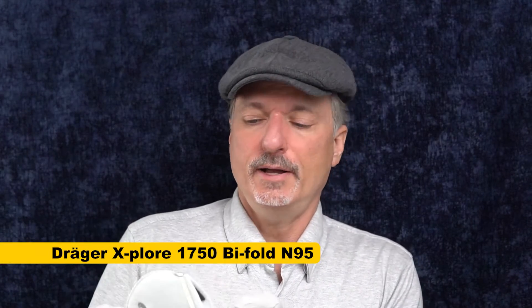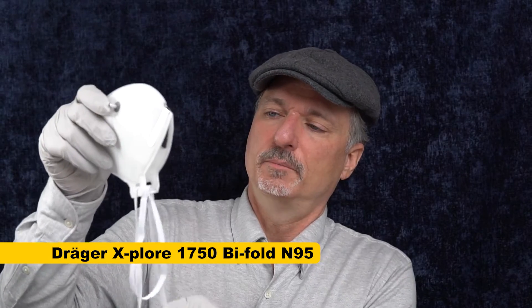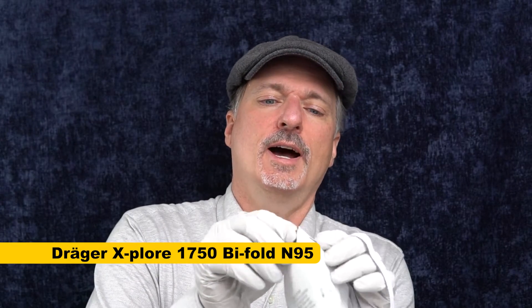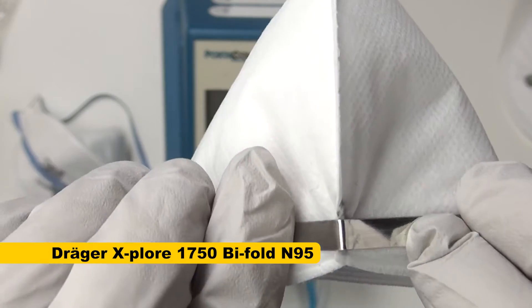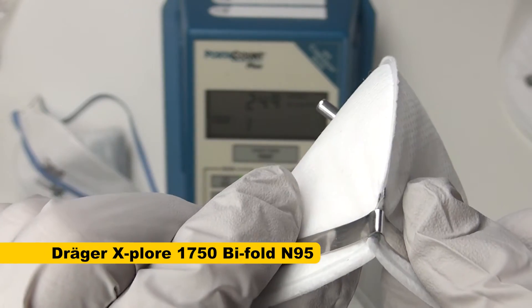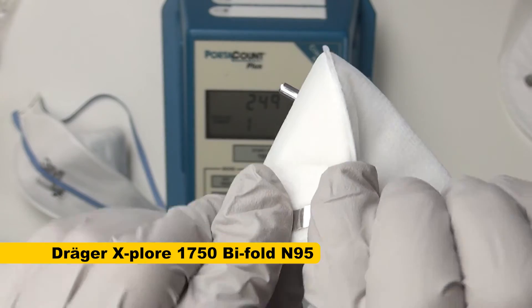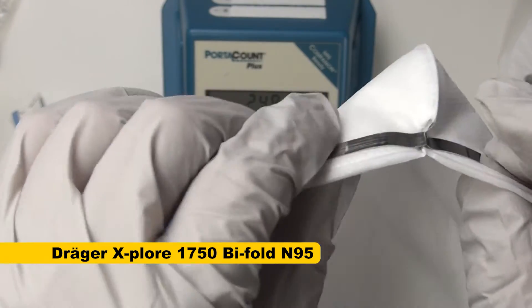Next up we've got the Draeger N95. I'm not a huge fan of this kind of solid strap, but we're going to find out how it works. It has that same sort of metal at the top that, when I bend it and try to flatten it, leaves a little gap. That's just a bad manufacturing defect — that shouldn't work that way. We shouldn't have to flatten these the way we do.